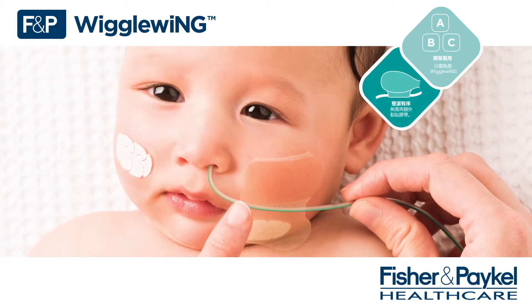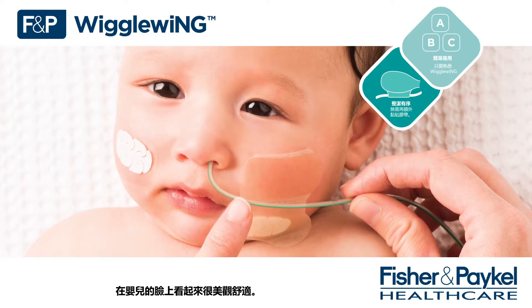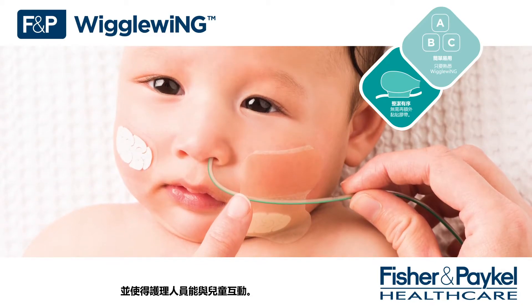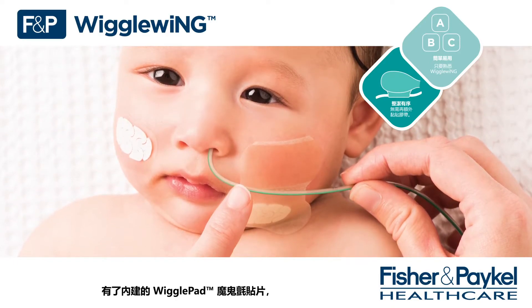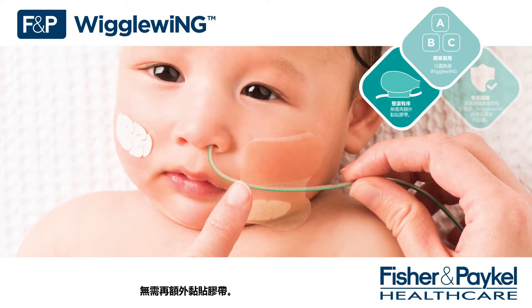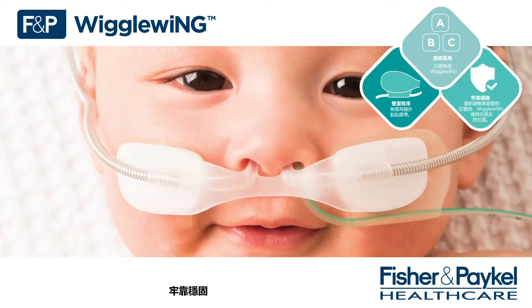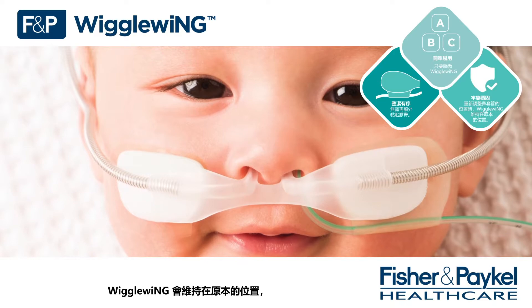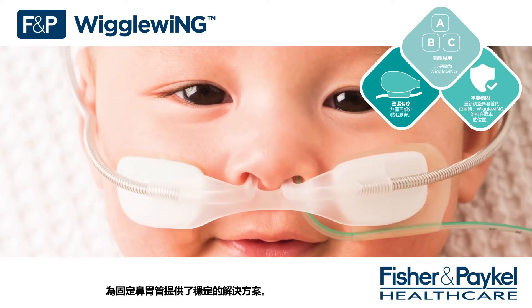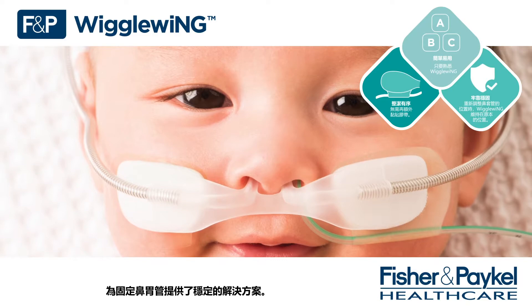Tidy — Wiggle Wing offers an elegant solution that looks good on a baby's face and allows caregivers to interact with their child. With inbuilt wiggle pad hook and loop, no additional tape is required. Secure — Wiggle Wing stays in place while repositioning the Optiflow Junior 2 or 2 Plus cannula range, offering a stable solution to NG fixation.